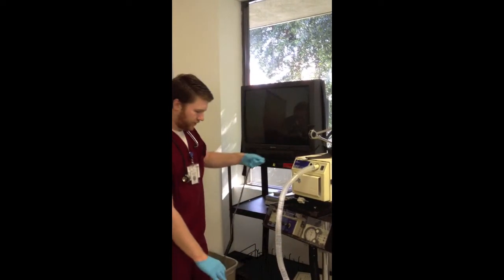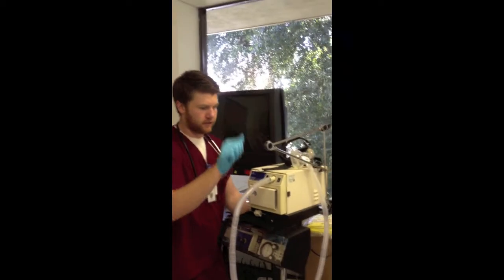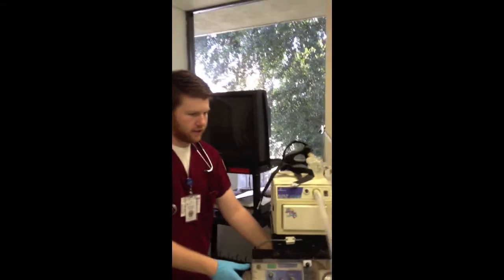Once this is done, enter the room after knocking on the door. Immediately identify yourself, your name, and that you're from respiratory. Next, ask the person their name and check their name tag.